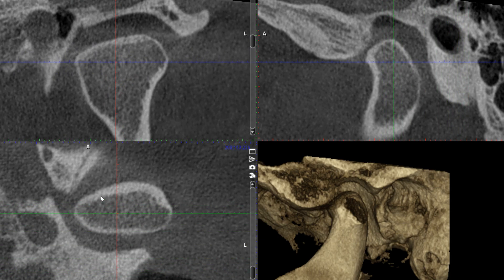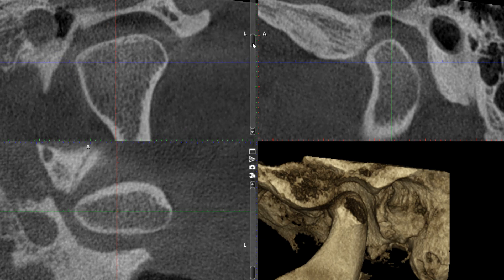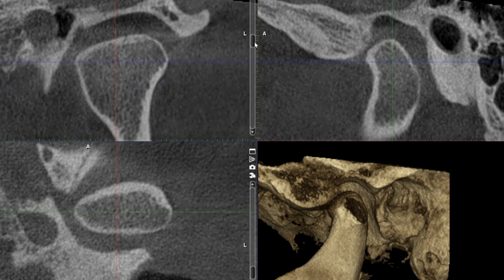Using a CBCT scan, we can capture a beautiful visualization of the patient's condyle. Why is this helpful? Well, patients may complain of TMJ joint pain, but from a panoramic radiograph you just don't have the detail needed to pick up early arthritic changes. But with cone beam CT and this level of detail, we can absolutely detect early signs of arthritic changes. Keep in mind, not all cone beam CTs can produce this type of image — it does need to be a limited field of view CBCT scan, not a large field of view that captures the entire patient's head. When you do that, you lose spatial resolution and the details of the condylar image.